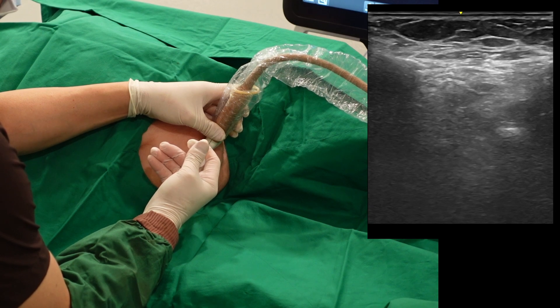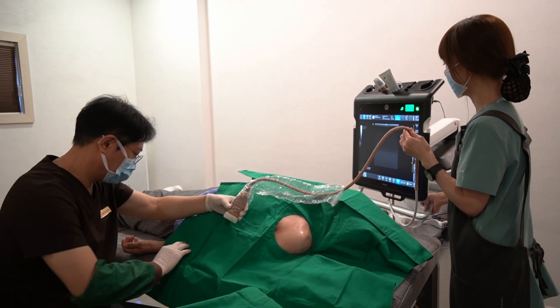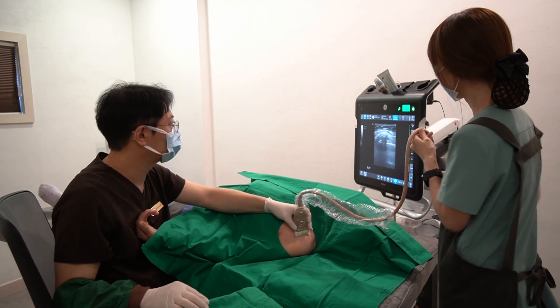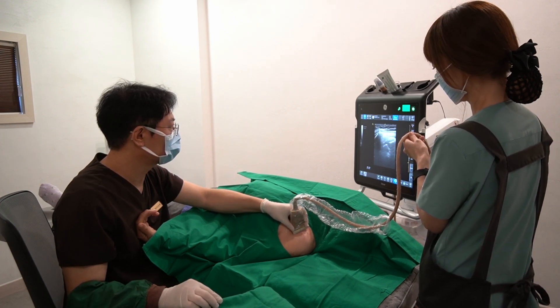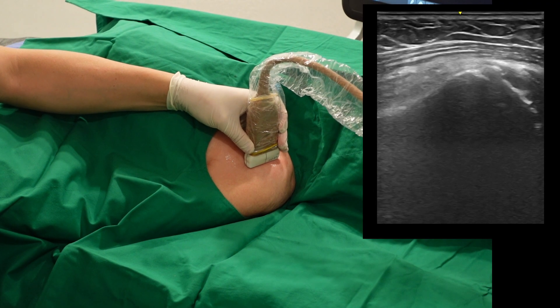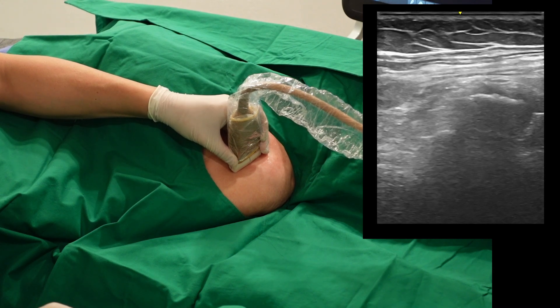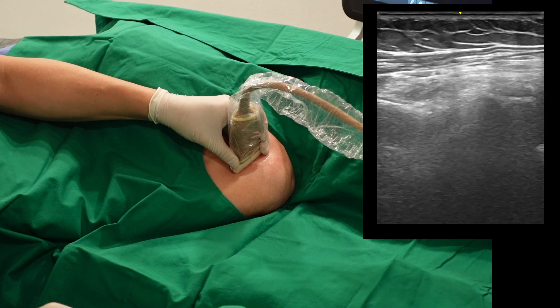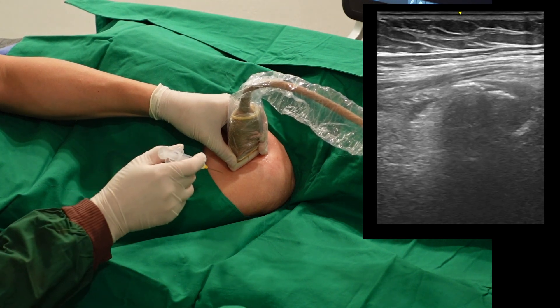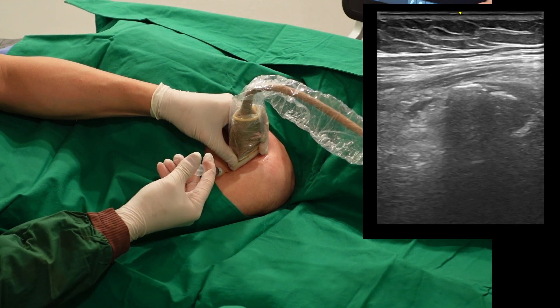I administered a drug comprising local anesthetics, steroids, and a Botox mixture. Next, I will switch the target to the inferior capsular injection. She cannot rotate externally, but I will try to rotate her arm as much as she can tolerate. After half-flexing her elbow, I pose my body between her forearm and body to use my dominant hand to hold the needle — the most comfortable position for the procedure. The right side is the acromial tip, and the left-hand side is the humerus on the ultrasound image. I follow the cortical echo of the humerus shaft, slide the probe more medially, and find a prominent downward-projecting osteophyte from the anatomical neck. The capsule is located peripheral to the osteophyte, so my needle target will be inferior to the osteophyte and into the inferior capsule.